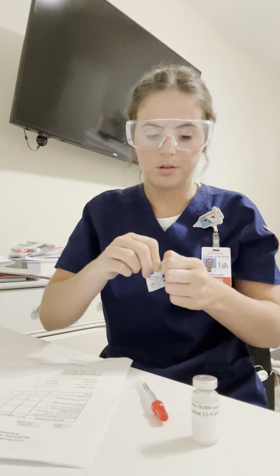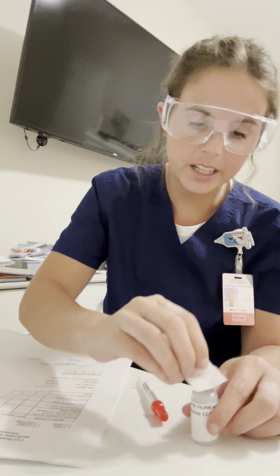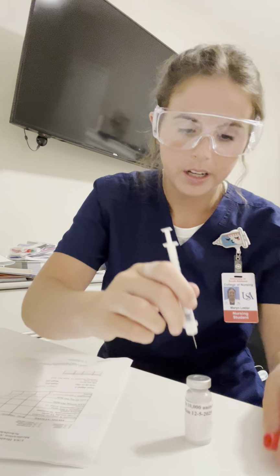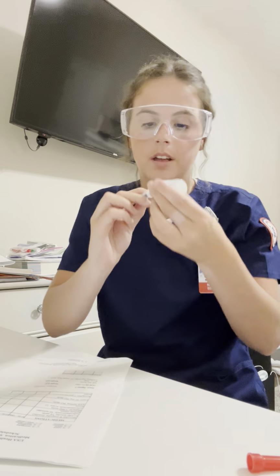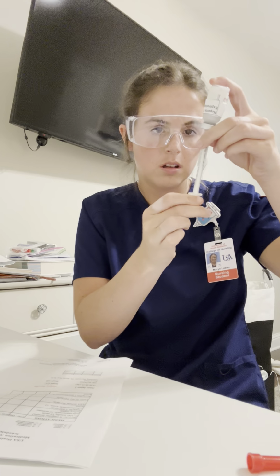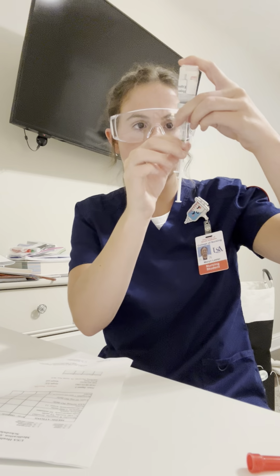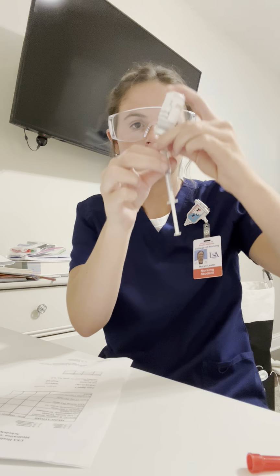So I'm going to take my alcohol swab. I'm going to clean the vial. Throw it away. And now I'm going to draw up 0.5 of heparin. Okay, I'm going to make sure there are no air bubbles. We're going to flick it.